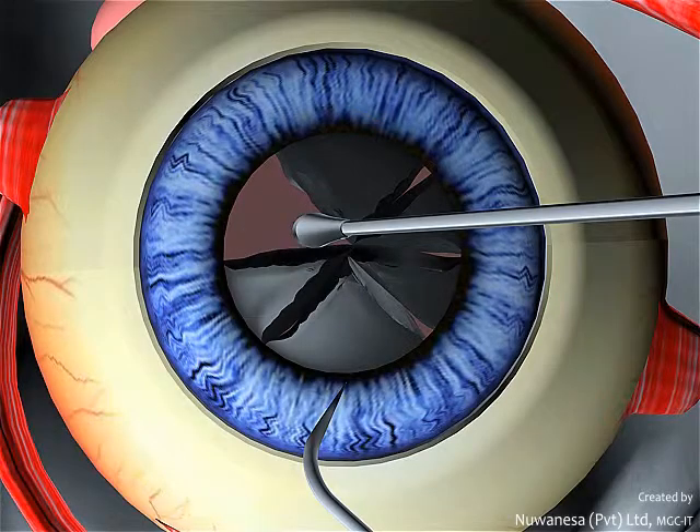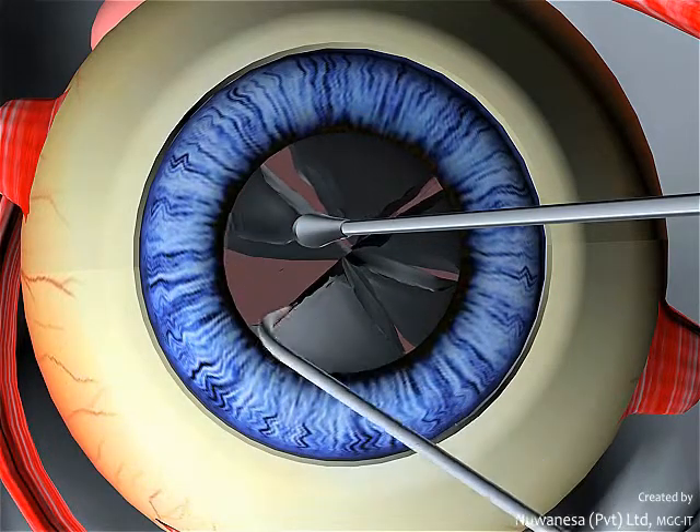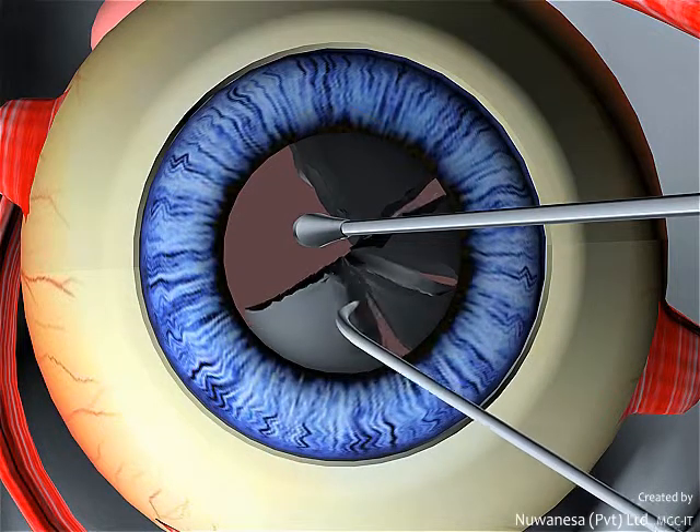Finally, the pieces are aspirated by the FACO probe to clear the capsular bag.